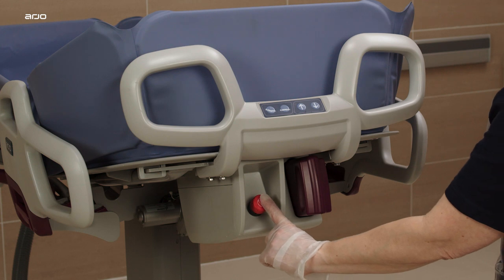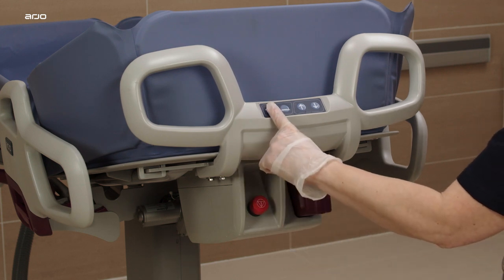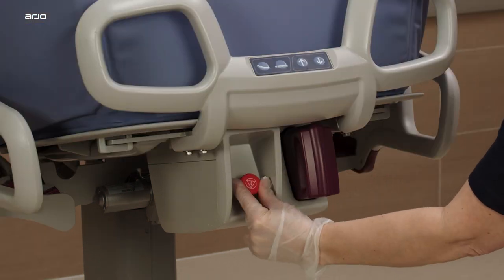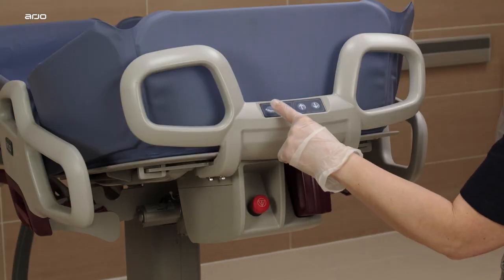In case of electrical malfunctioning, all functions can be stopped by pushing the red emergency stop button. To reset this function, turn the red button clockwise.